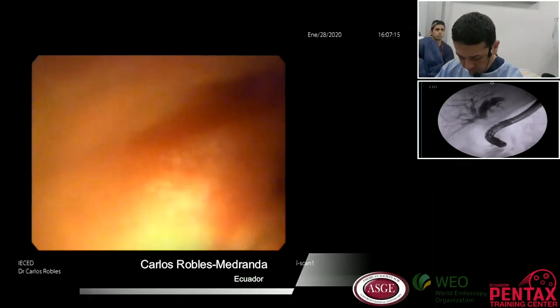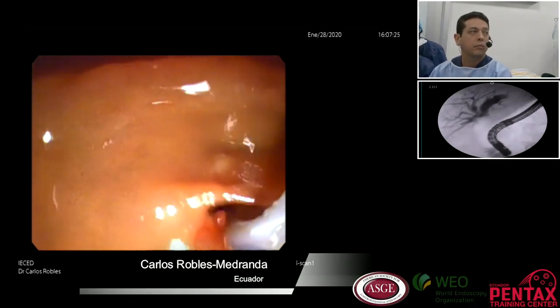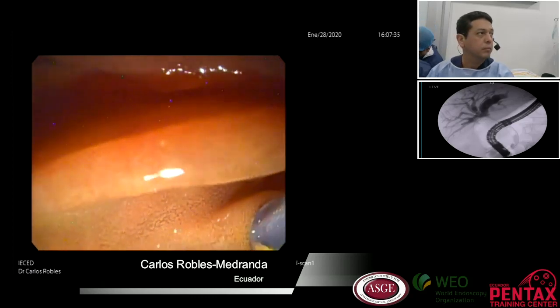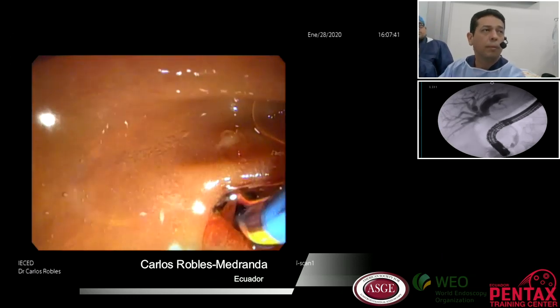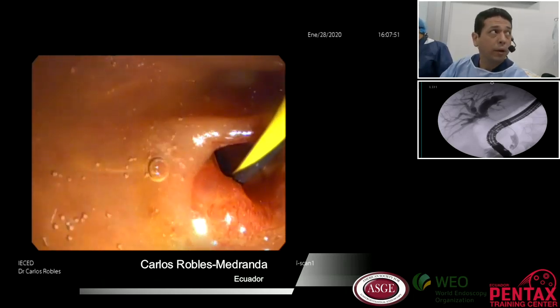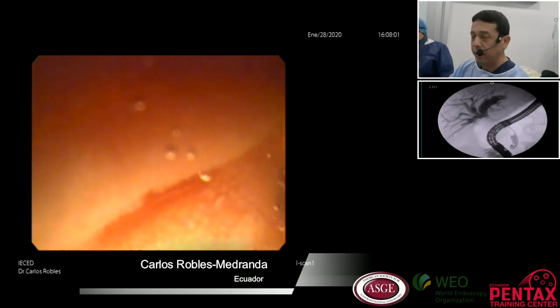Ok, pasa la guía e inyecta contraste. Ok, perfecto. So we are very good now. Inyecta. Ok. Ok, empuja. So we can see the stenosis, the stenotic area, and we left in place our guide wire. Finally, I will pass my radio frequency now.